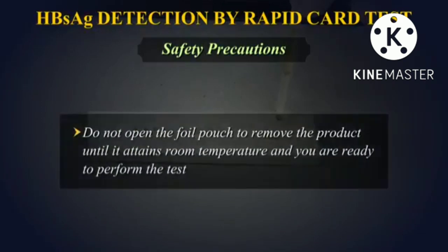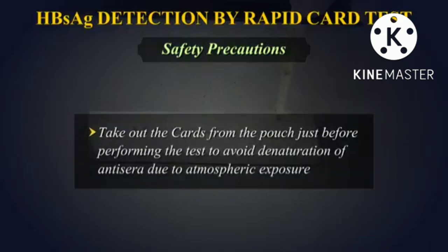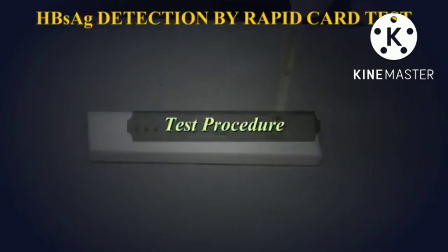Do not open the foil pouch to remove the product until it attains room temperature and you are ready to perform the test. Take out the cards from the pouch just before performing the test to avoid denaturation of antisera due to atmospheric exposure. Test procedure.